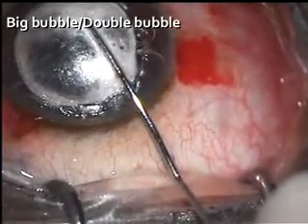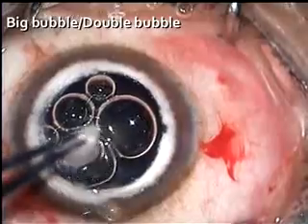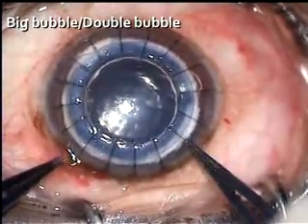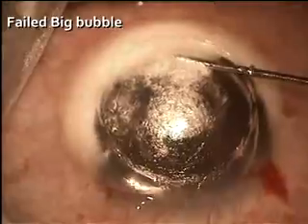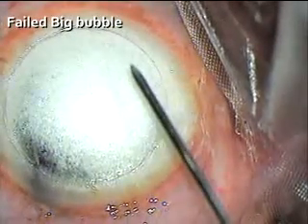Big bubble is the most popular technique for Descemet separation in deep anterior lamellar keratoplasty. It is challenging yet rewarding corneal surgery. It is not always easy to achieve the big bubble. Finding the right depth can be quite difficult at times.